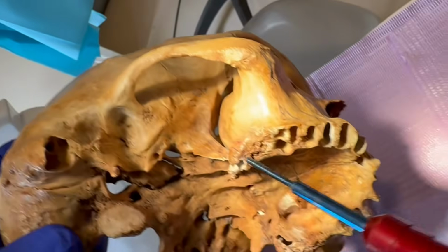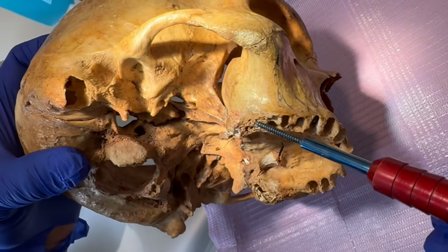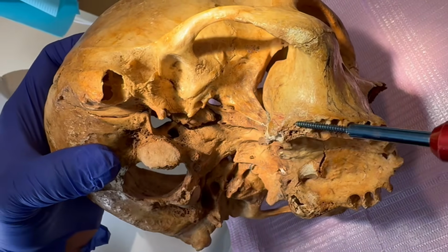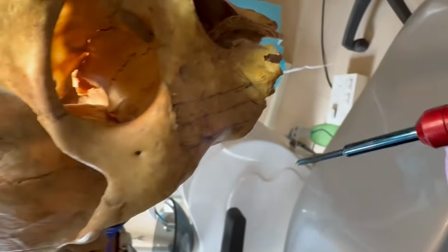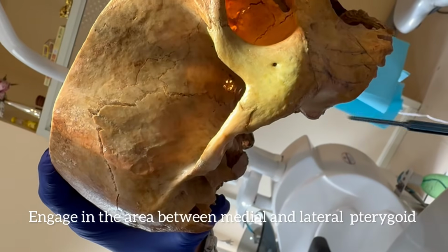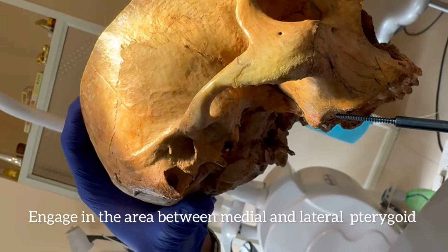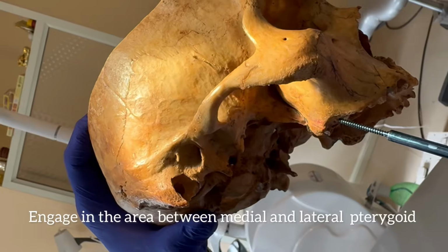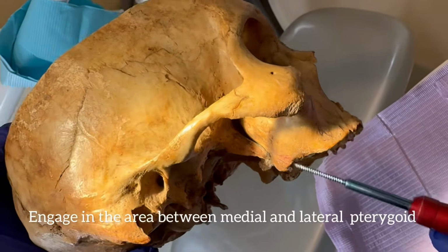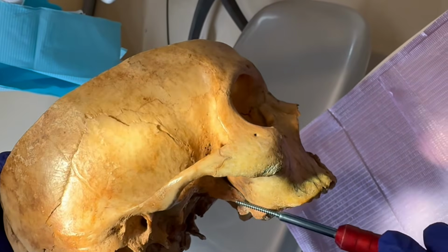Okay, this is the pterygoid region. So start your osteotomy from the distal root of the second molar, more buccally, and you point it towards medially. The angulation may be 40 to 45 degrees. Okay, this is your maxilla. It goes this way, it goes this way, like this. It has to enter the fossa, then only you will get that good anchorage and stability. So through tactile sensation you drill for some distance, feel for the bone, then you go further. You can place up to 30 to 35 mm.